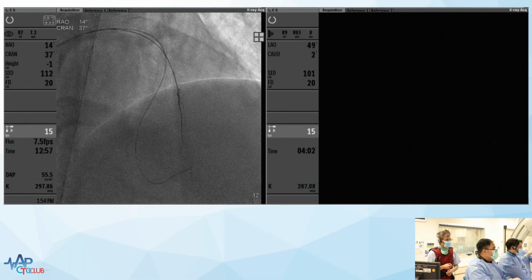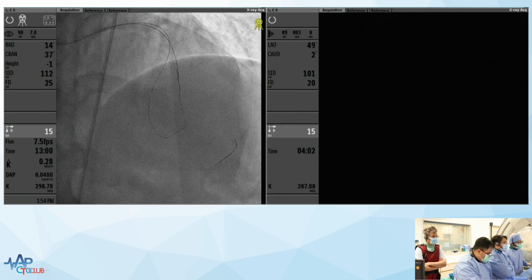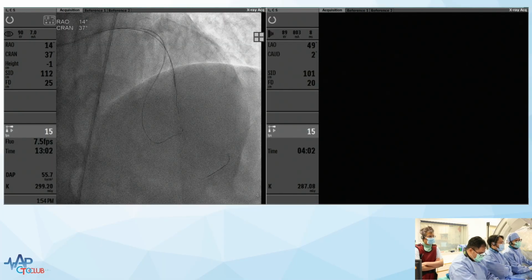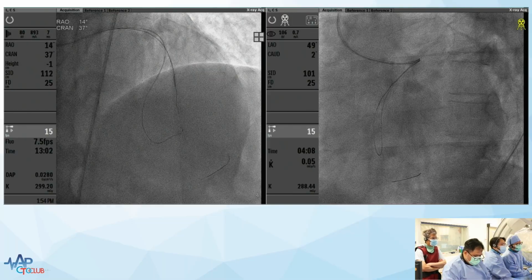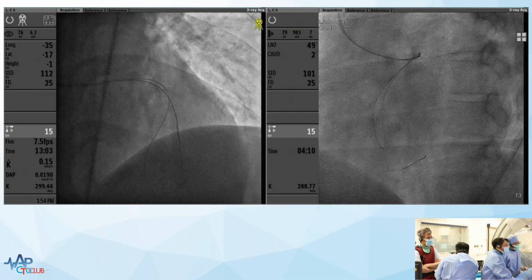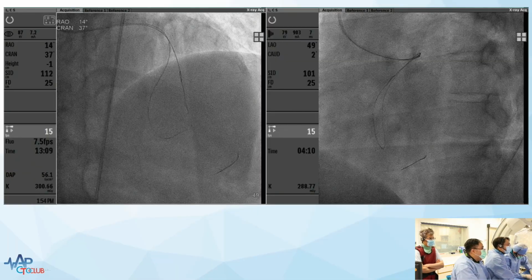But I think just guide injection is okay to check the channel, right? Because I think I have to back off the microcatheter touch, but need to control the guiding, because the guiding is going to suck in. This is the joy of using one. Very complicated.